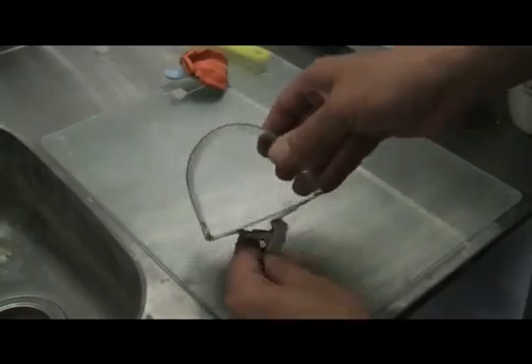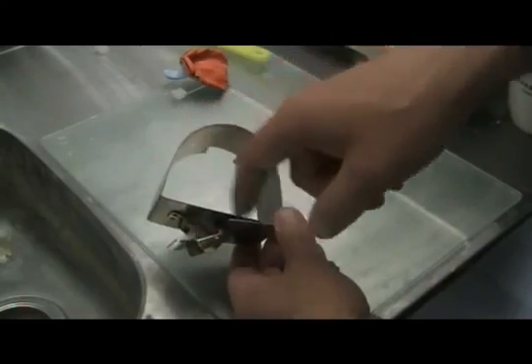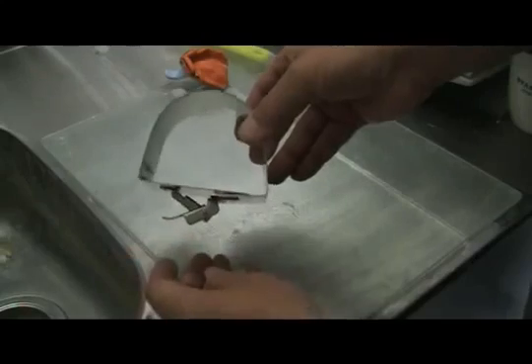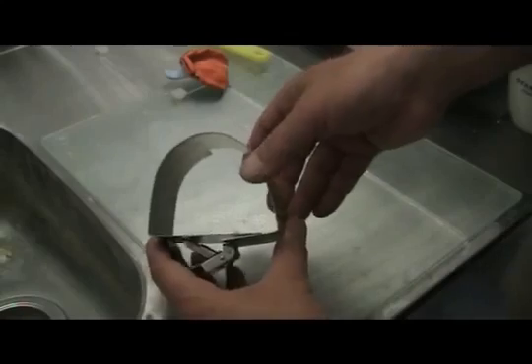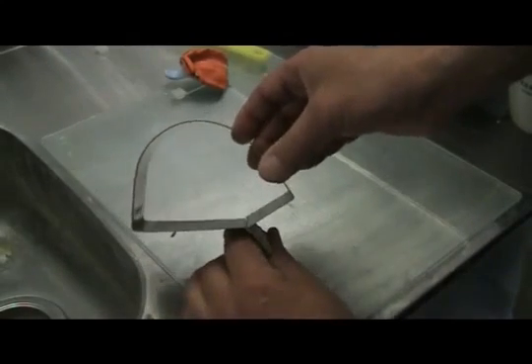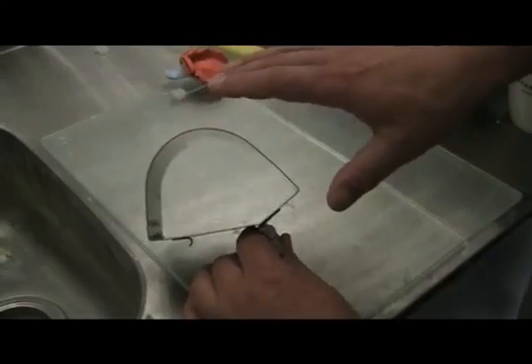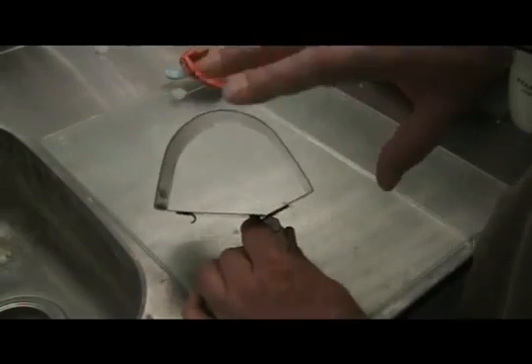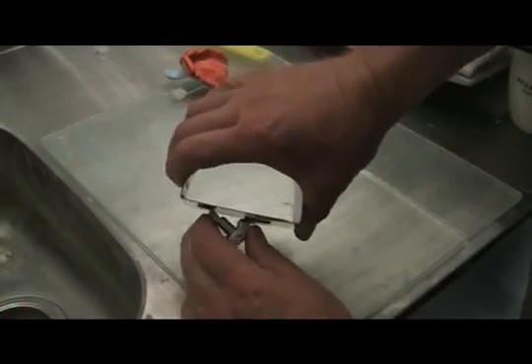If you have a larger impression, you can always unlatch it by one notch. Just leave it open, basically, rather than closed, and that will buy you about a half inch on either side. If you get extremely large or wide arch forms, you can also unlatch it entirely and let it rest like that. You can see the amount of space that you gain. It just means you'll have to use a larger patty of Wonderfill material in order to compensate for how far open it is. But in the long run, this is the best way to accommodate the larger arches.